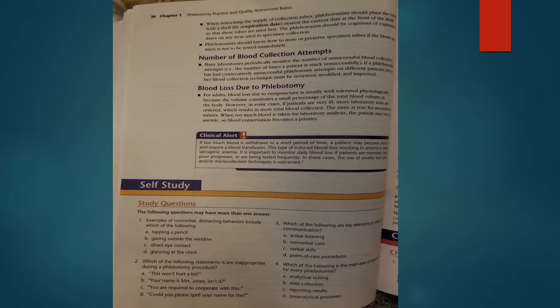The phlebotomist should be cognizant of expiration dates on any item used in a specimen collection. Phlebotomists should know how to store or preserve specimen tubes if the blood specimen is not to be tested immediately. Number of blood collection attempts. Many laboratories periodically monitor the number of unsuccessful blood collection attempts, that is, the number of times a patient is stuck unsuccessfully.